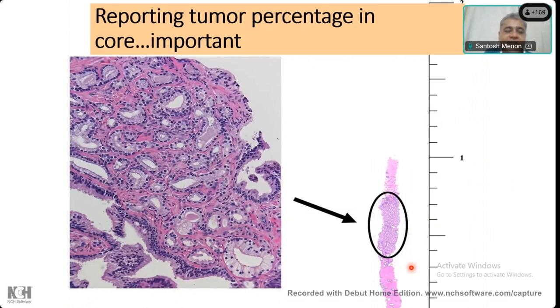There is something very, very important along with the Gleason, which is the percentage of the core. Now, this is a very, very controversial issue. Again, I will definitely not delve into details of this, but I'll tell you what is the practical importance of it. So this is the core of the tumor you see here. These are the benign glands at the bottom, but this is all a complete tumor. Understand? So if you roughly eyeball, this forms around 30-40% of the total core of the prostate.